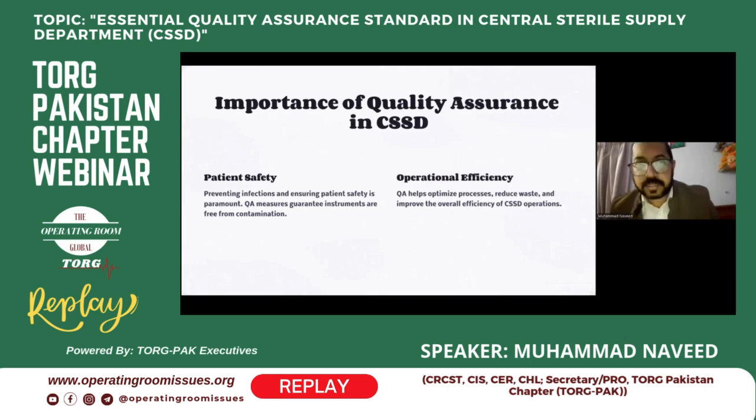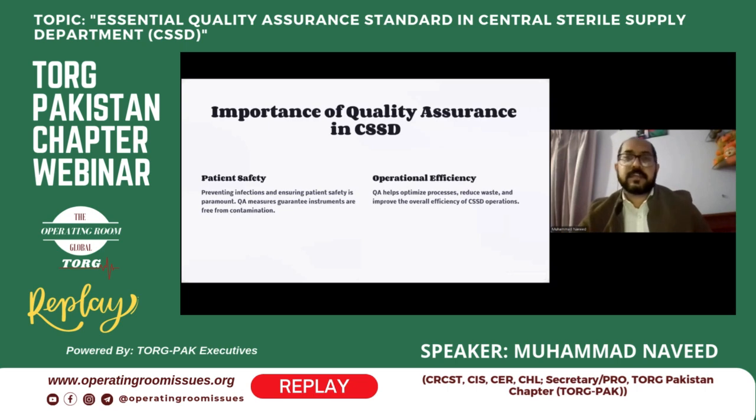So the main importance of quality assurance is patient safety and operational efficiency. When we are talking about the quality assurance standard, there are two goals in our CSSD. First is patient safety. Preventing infections and ensuring patient safety is paramount. Quality assurance measures guarantee instruments are free from contamination. So the first goal is that when we deliver the instruments to the OR, they should be free from contamination. And the other most important thing is operational efficiency.